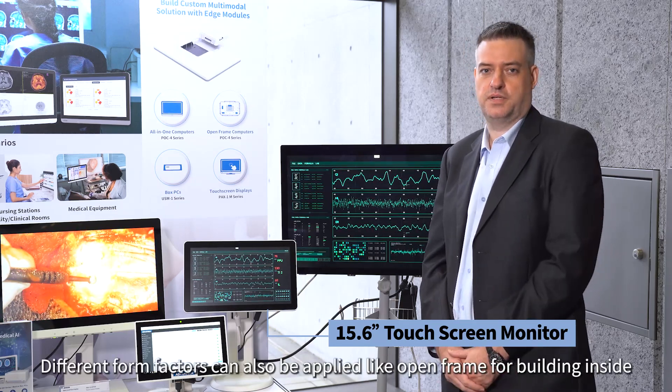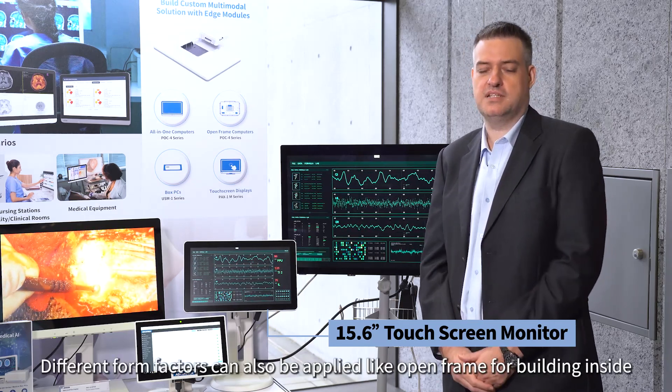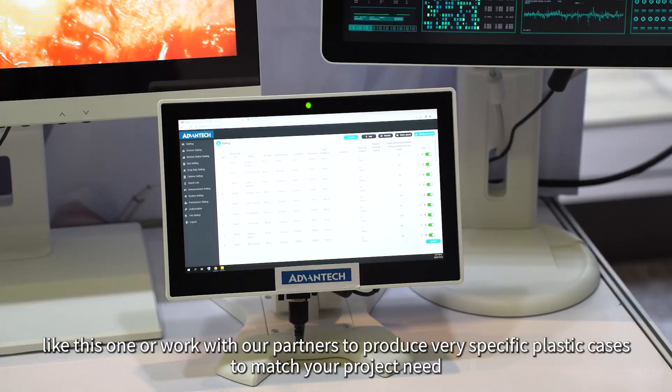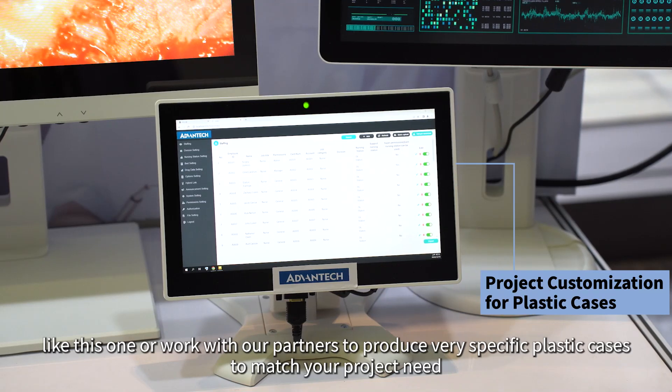Different form factors can also be applied, like open frame for building inside other machinery and equipment. We can also use alternative plastic cases like this one, or work with our partners to produce a very specific plastic case that matches your project need.